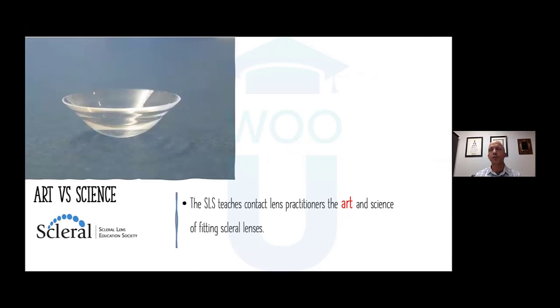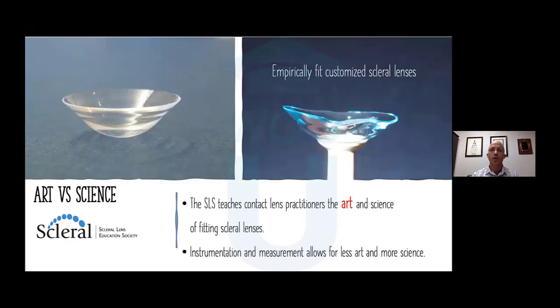And in fact, if we look at part of the mission statement for the Scleral Lens Education Society, that statement starts out, the Scleral Lens Education Society teaches contact lens practitioners the art, and emphasis on art, and science of fitting scleral lenses. Well, we now know that instrumentation and measurement allows for less art and more science. And in fact, we can use instrumentation, we can use measurements to empirically fit custom scleral lenses.